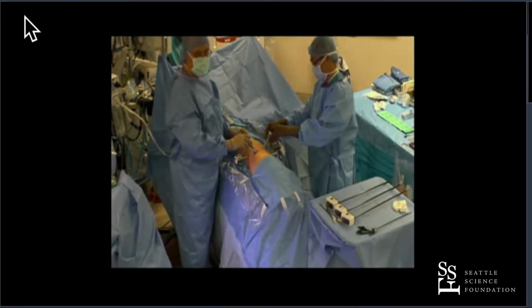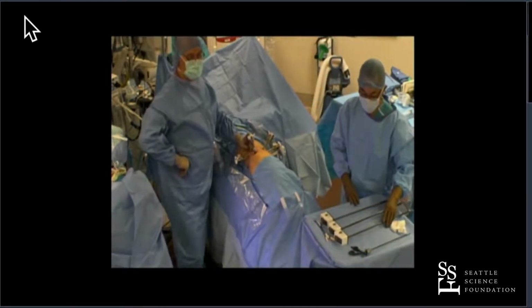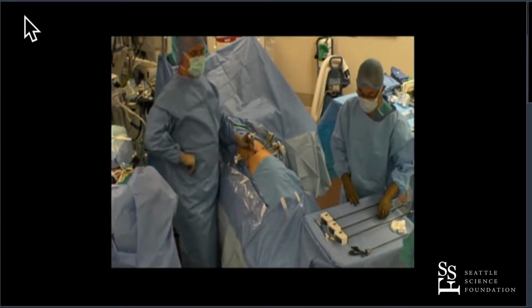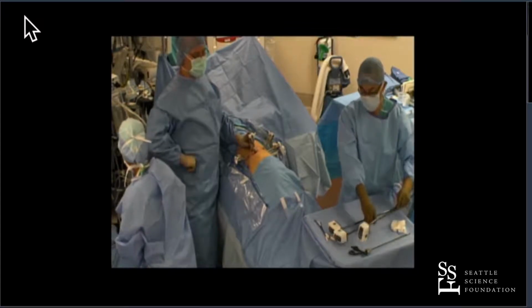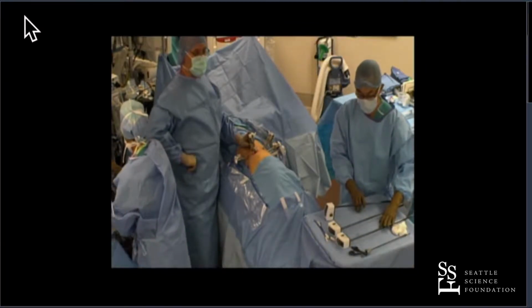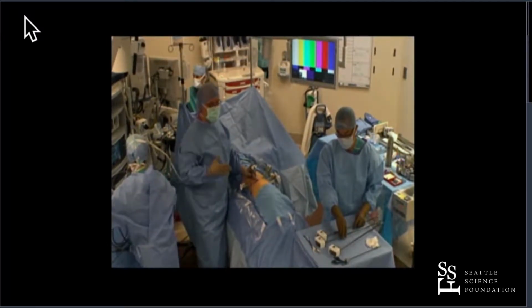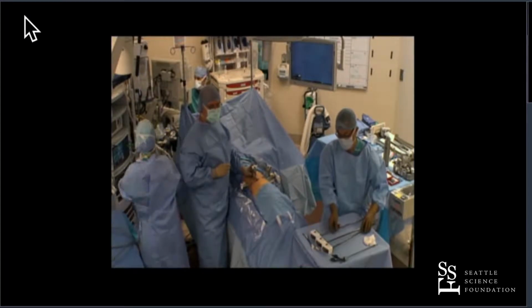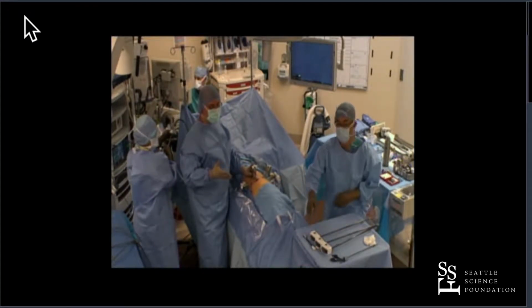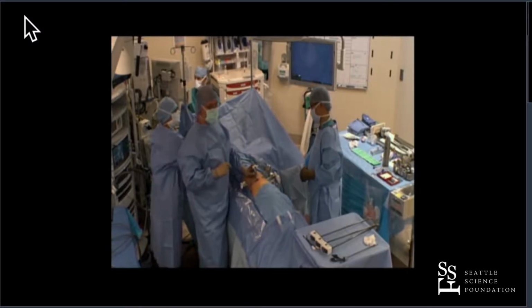So, Jim, do you routinely use the zero for this case? Do you ever use 30 up, 30 down? Never. I'd say never on anything, but one time I actually had to use a 30 up lens because it was a very large, very high hip. We were on the hip the whole case, and the way to get off the hip is to go 30 up. 30 down is worse, of course. You're on the hip even more.